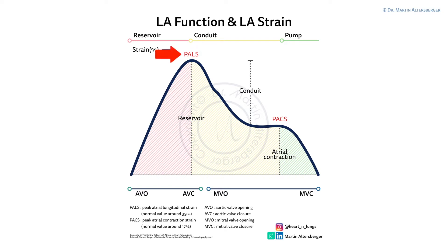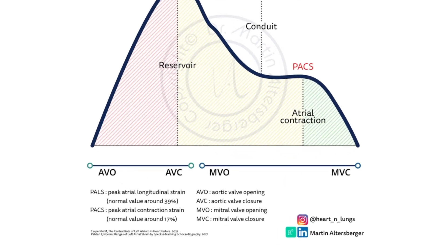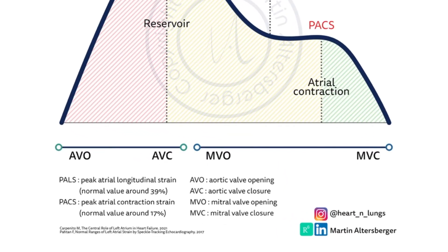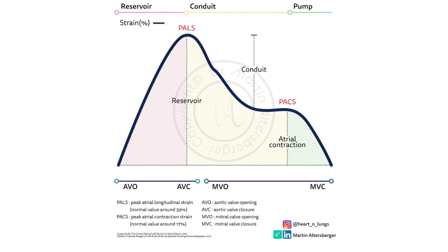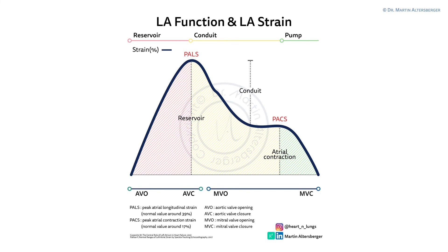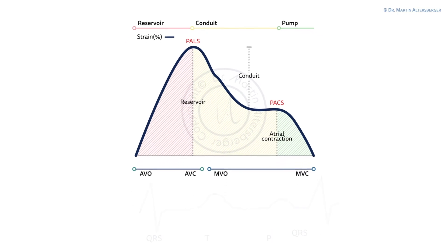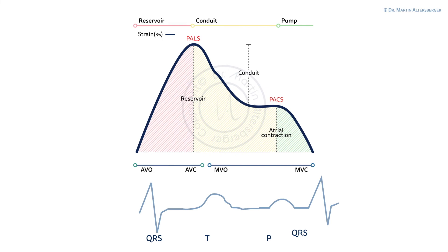There are several measurements we can obtain. The first is the PALS — peak atrial longitudinal strain — and the second is the PACS — peak atrial contraction strain. The normal value for PALS is around 39 (a positive value), and for PACS approximately 17 (also a positive value). If you compare the LA strain with the ECG, you see the QRS complex, the second QRS complex, the T wave, and the P wave.